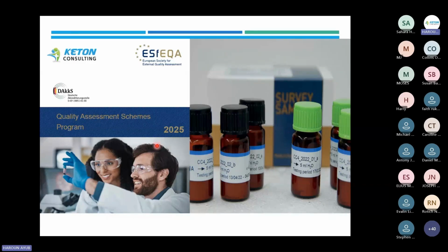Remember, for urinalysis this year, we had been running urinalysis in liquid form from, let's say, 2017. But this year, when cycle 3 came, we introduced lyophilized urine samples and another sample that is in liquid form. So if you don't read the reconstitution instructions, you might feel like, oh, I got the wrong samples or the samples have dried and so on. So remember, each and every survey, just take 1 minute to read the IFU. You'll get the changes or check on the stickers.